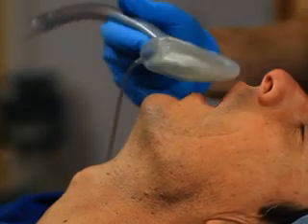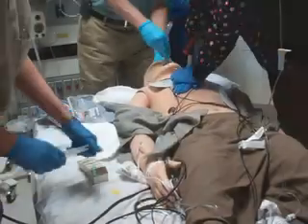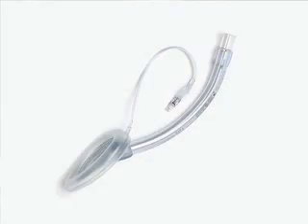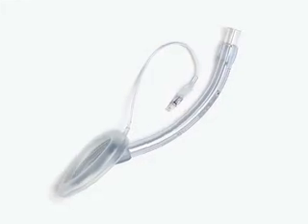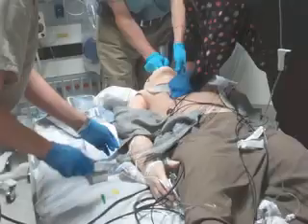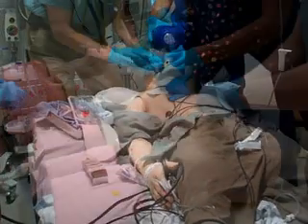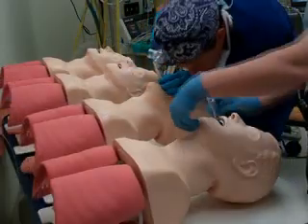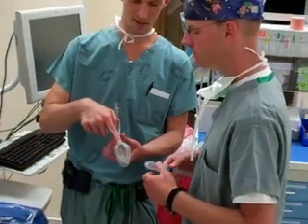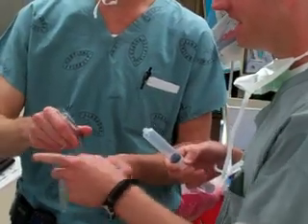This video will demonstrate the placement of the Laryngeal Mask Airway, or LMA, as an emergency airway device in patients experiencing a cardiopulmonary arrest. The goal is to provide familiarity with and instruction in its use so that a clinician will be comfortable using this device to provide effective ventilation for patients in cardiopulmonary arrest. Instruction beyond this video is necessary for safe and effective placement of a laryngeal mask airway, and the clinician should seek further training from anesthesiologists or others who have expertise in its use.